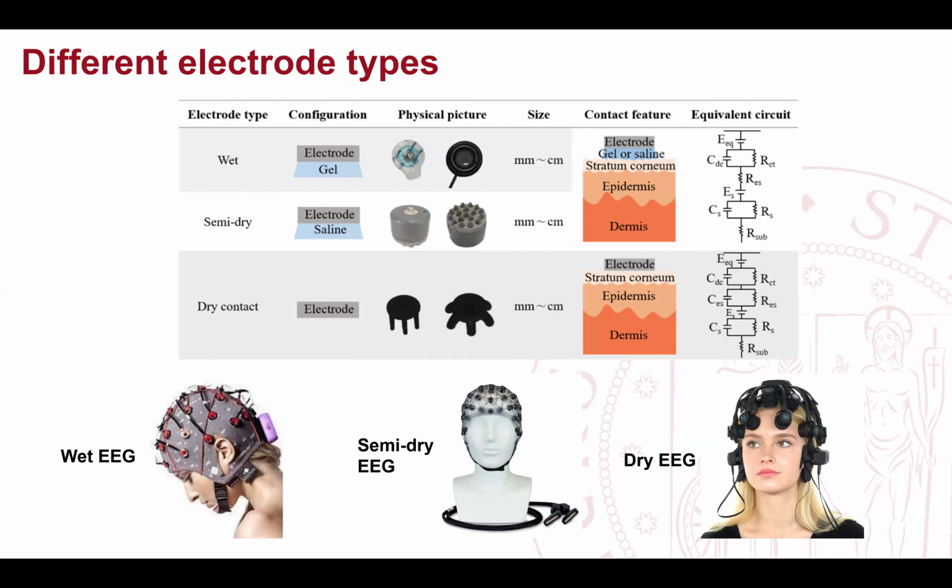I have to say that I tried this one, which is the net from Fron Neuro. This is a very, very good system. So we are now buying it to use in our experiment because they almost provide the same quality as the wet, but it's super simple. You just place in the water, place it on top, and that's all. And then you just remove it, and eventually you will have your hair a little bit wet, but it's fine.